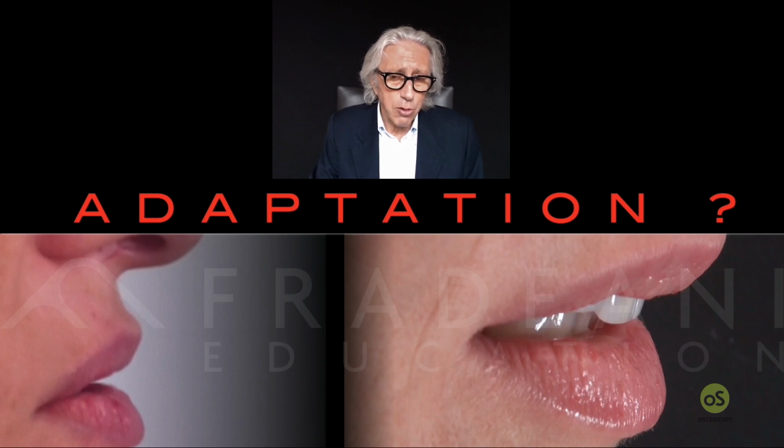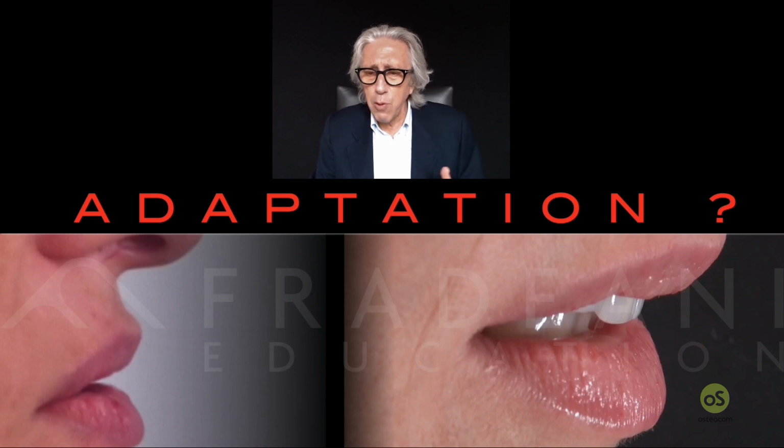And on the right side, you already see the answer. Why? Look how long the teeth are. I elongated them by 3.5 millimeters, 10.5 now the new length. How could I do it? They were touching each other already when they had short teeth. Now that we have elongated them, how can you avoid it? That could be the question.